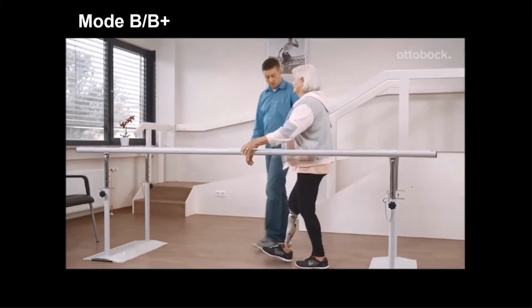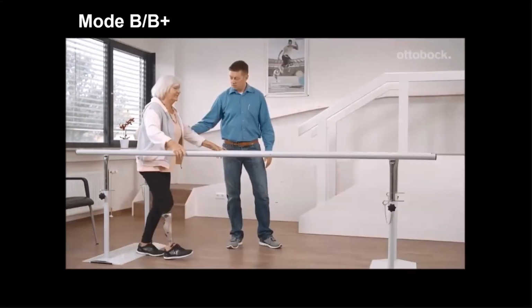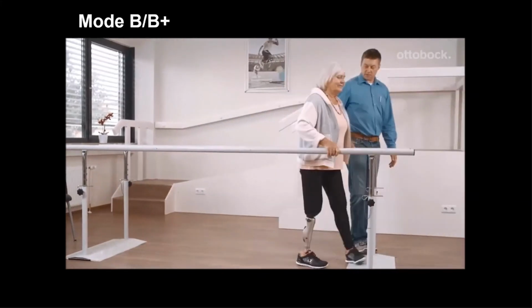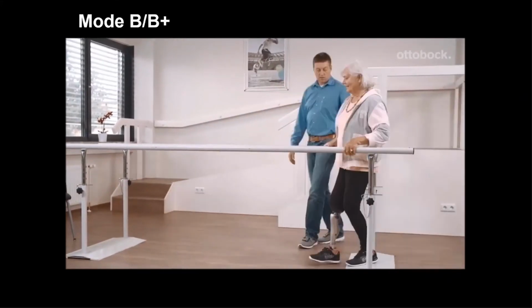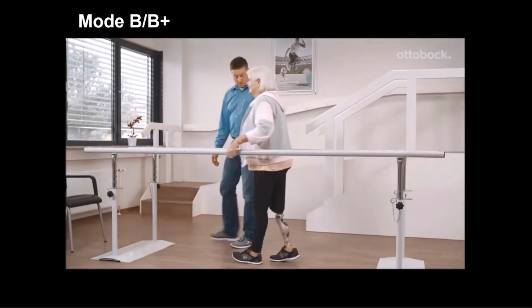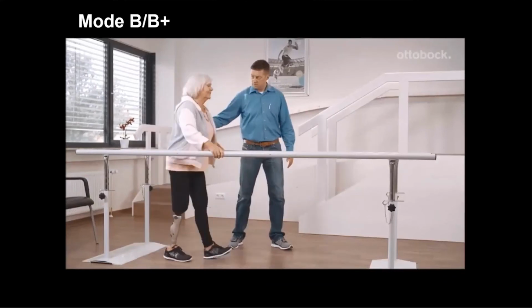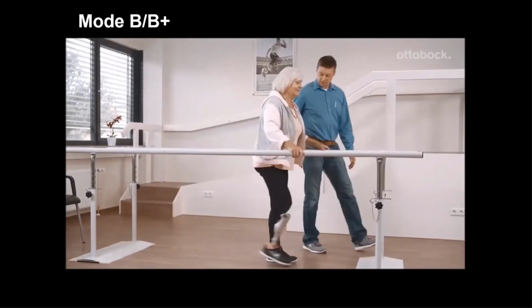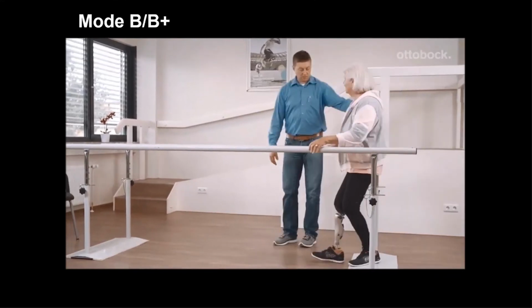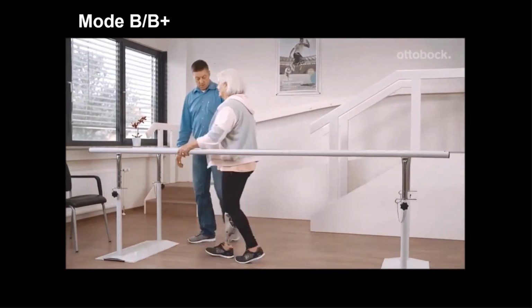And this is where Dr. Kannenberg was really distinguishing between the functional capabilities of the C-leg versus the Kenevo in mode B and B plus, especially walking with a walker, because that threshold of meeting the highest point of load, because the Kenevo has a load cell in it, and it can sense when that individual is in the late part of the gait cycle, whatever step they're taking, and release the knee at the appropriate time.